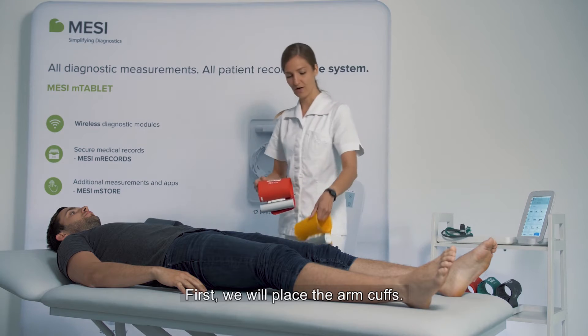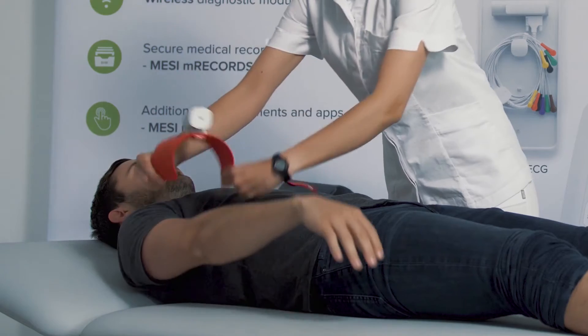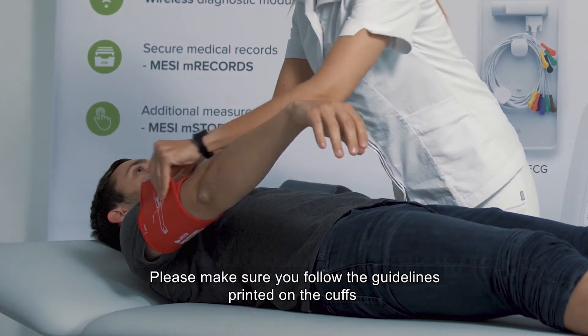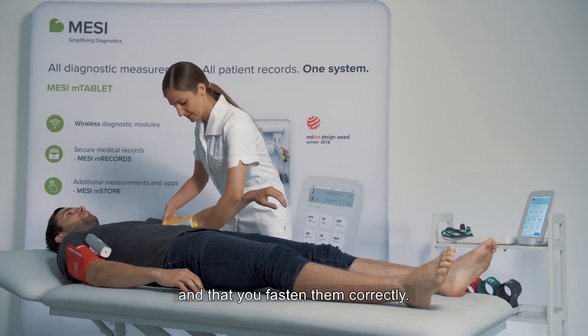First we will place the arm cuffs. Please make sure you follow the guidelines printed on the cuffs and that you fasten them correctly.